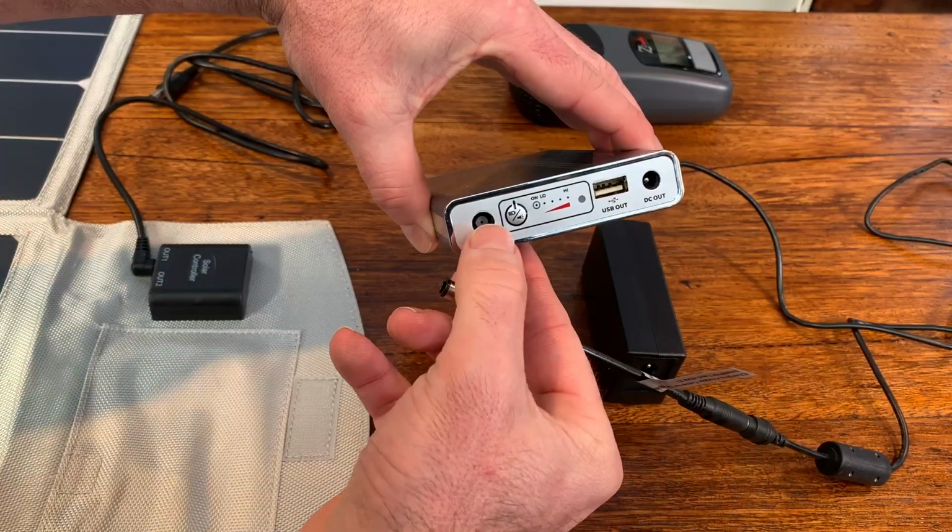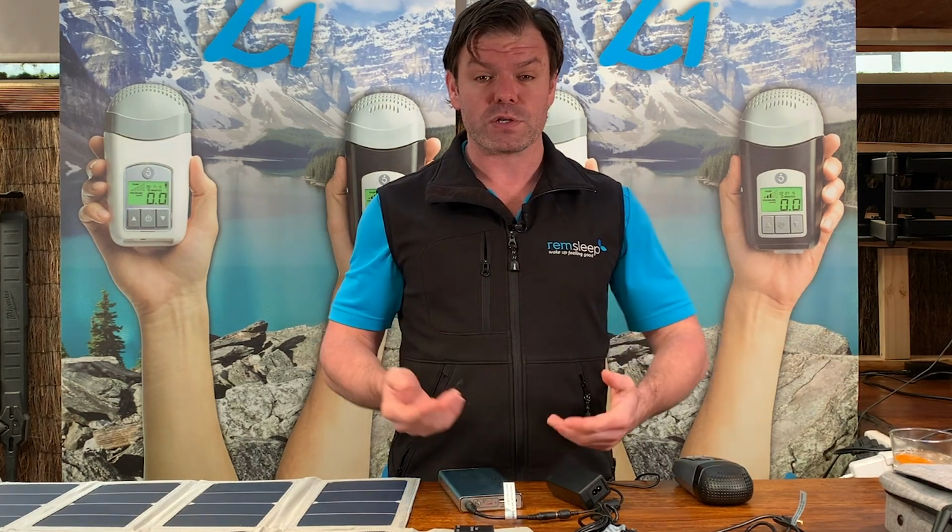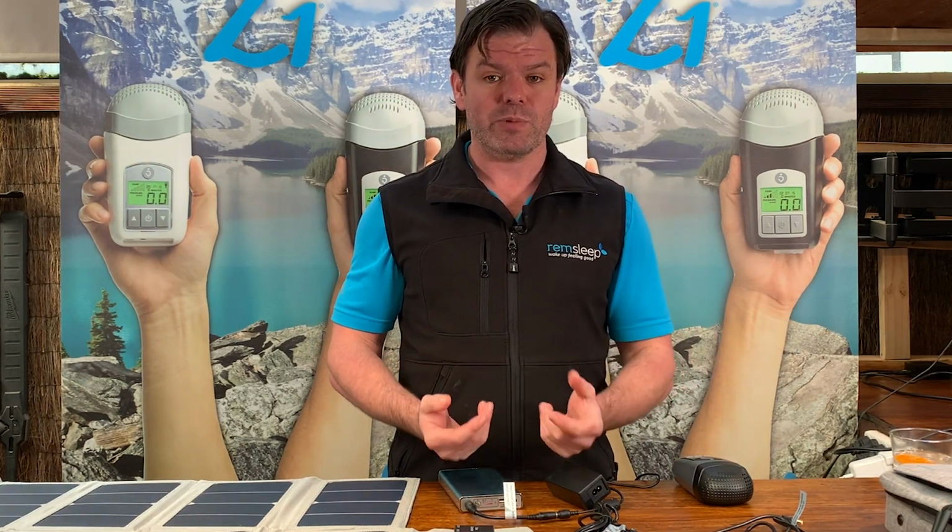It says charge here at the front. Plug it into the charge, and then the other end goes into your wall, and you're good to go. And that's gonna take about 2 to 3 hours to charge from flat to full. So it's a really fast charging time, which is great.